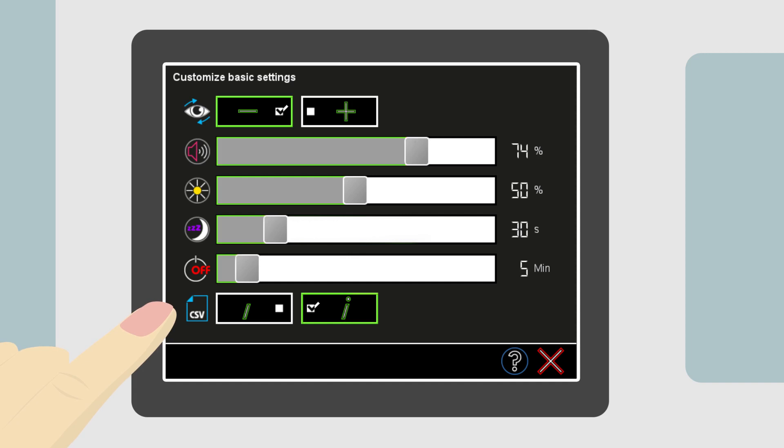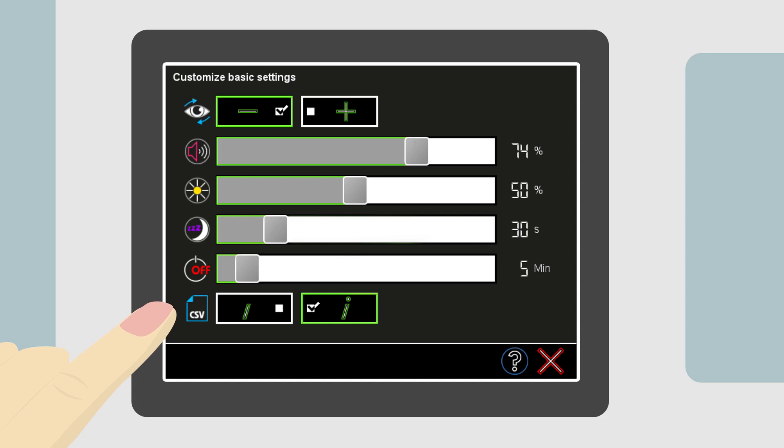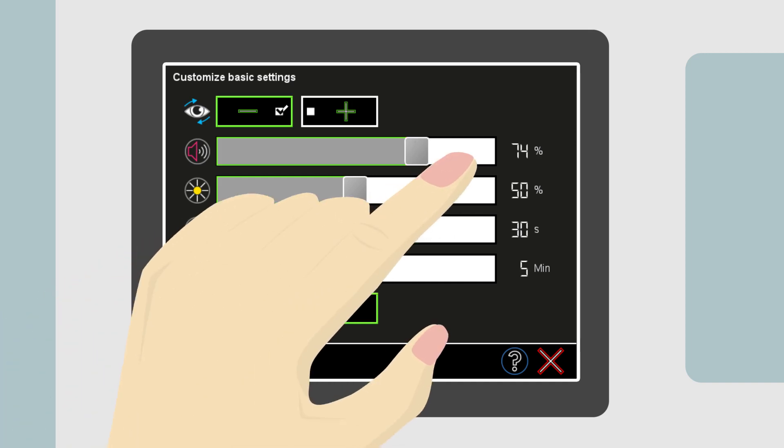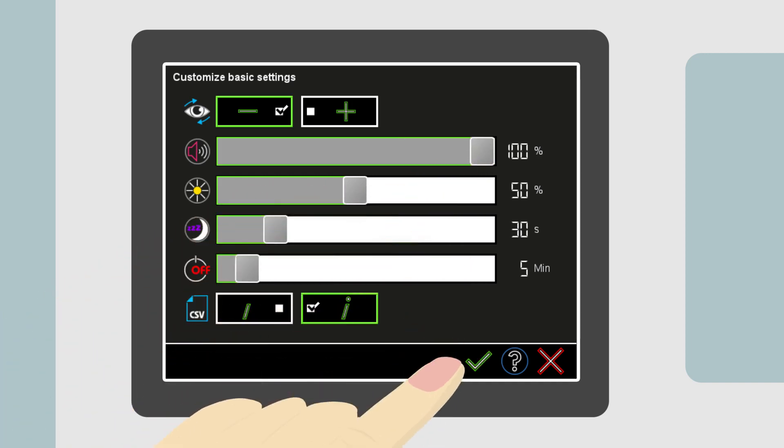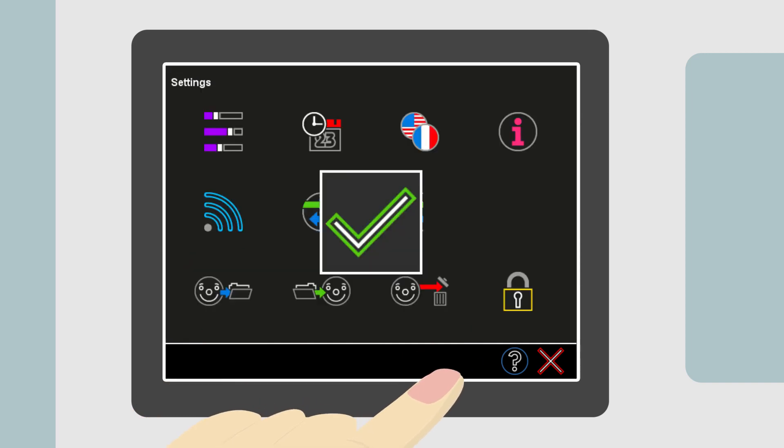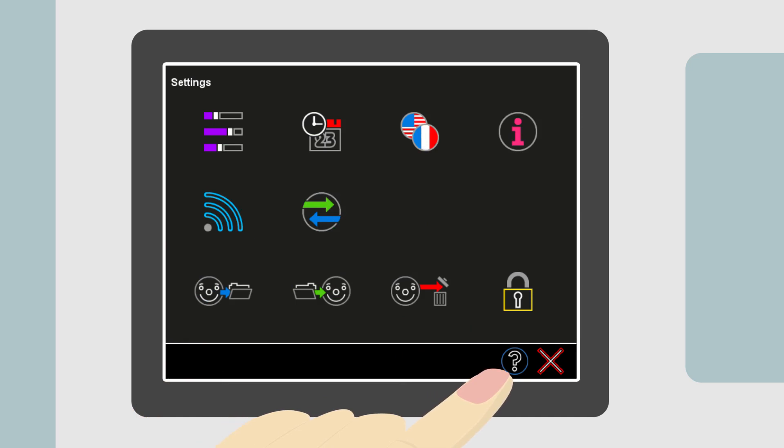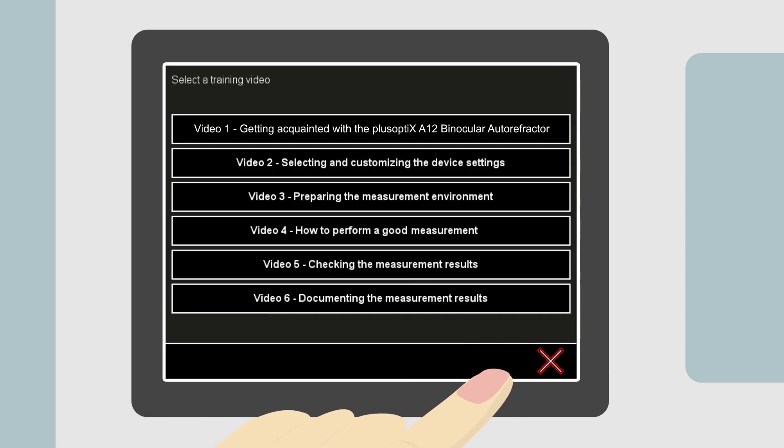Notice that when Anna changes the volume, a green check mark appears in the navigation bar. Touching the green check mark saves any changes she has made. Touching the question mark button in the navigation bar will show a list of useful training videos. You can learn how to prepare a measurement area and how to handle the device. Please note, watching the training videos does not replace reading the user manual.